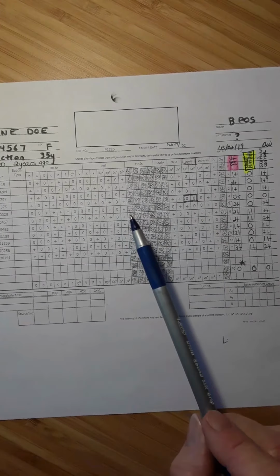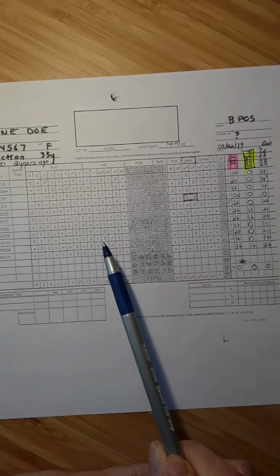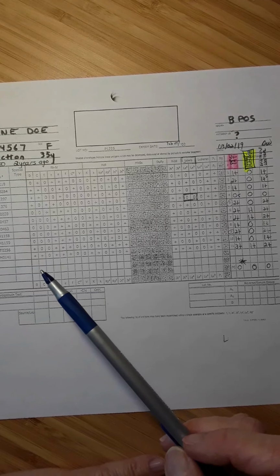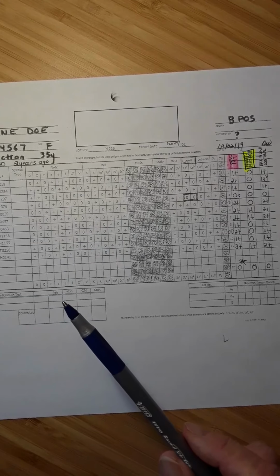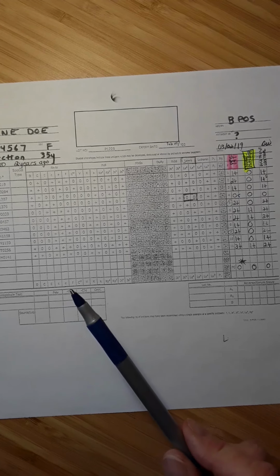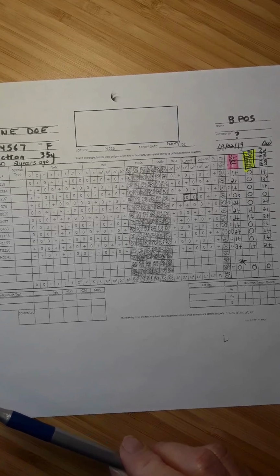To do that, you add to the patient's plasma, not in this tube, but another test tube with patient plasma in it, you add neutralizing substance. So this is called Lewis neutralizing substance, and it's made up of soluble Lewis antigens.